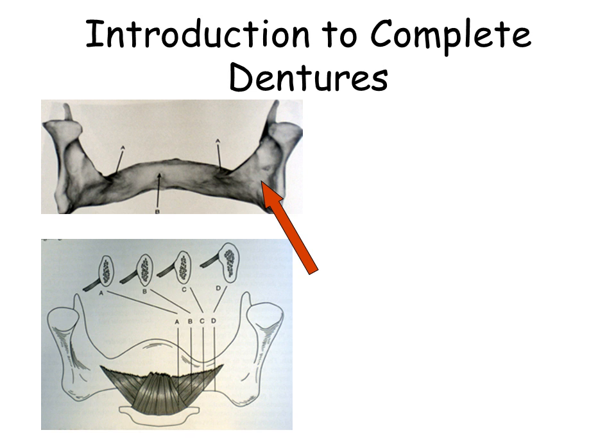The retromylohyoid fossa is the area posterior to the mylohyoid muscle. The action of the mylohyoid in forming the lingual border of the denture must be recorded in the functional impression by asking the patient to lick the upper lip.